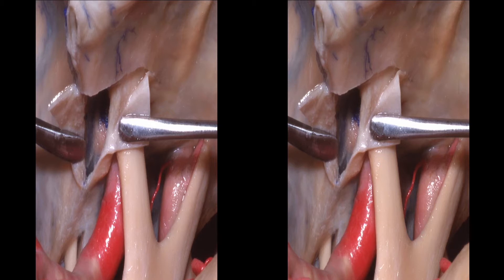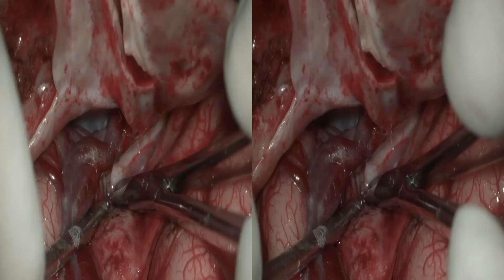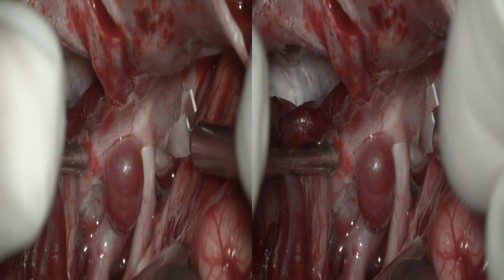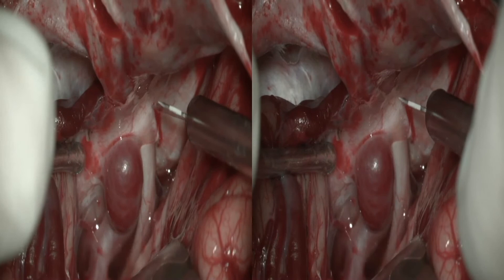The microsurgery starts by dissecting the sylvian fissure from distal to proximal. The anterior clinoid process was exposed, observing the aneurysm originating from the clinoid segment of the carotid artery, making it impossible to perform clipping without an anterior clinoidectomy.